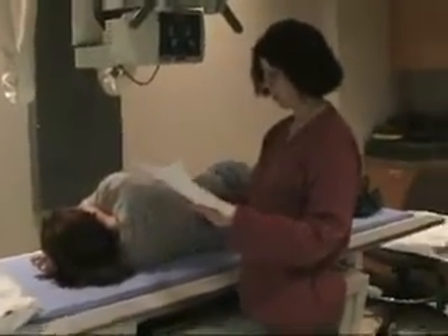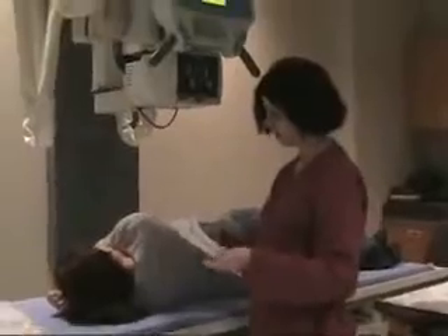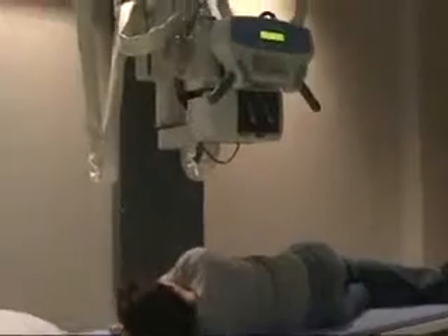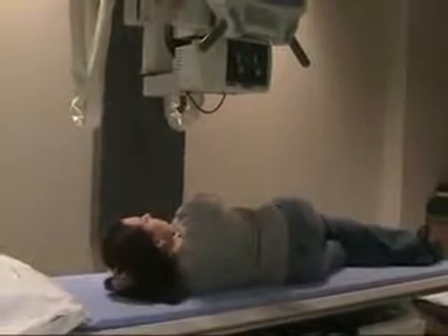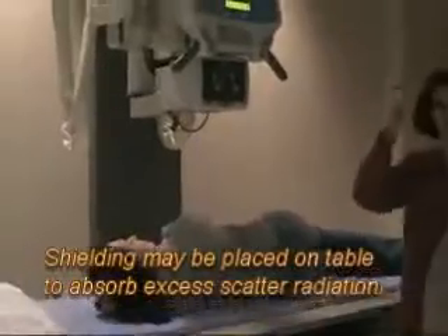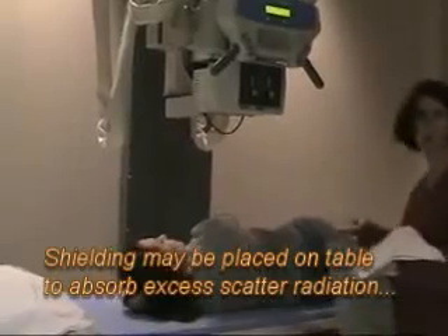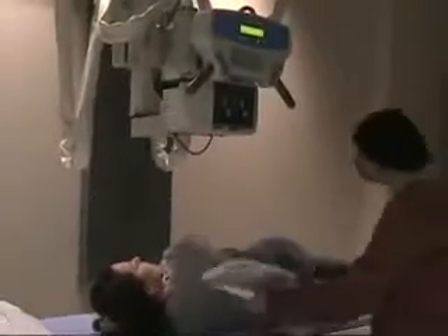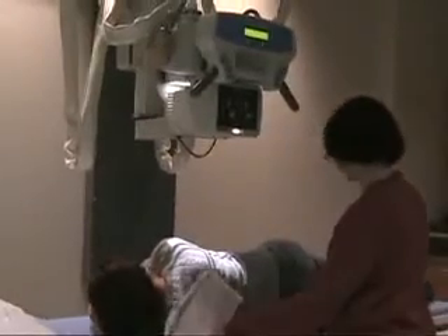Let's make sure we did everything. We'll find our lead mask. When you get to these laterals of the spine, the part is so big that you're going through — you have a lot of scatter. So for the lateral thoracic, and when we get down to the lumbar we use it too, especially for the spot. We have a lot of scatter, so we'll just put it right behind to absorb some of that scatter.